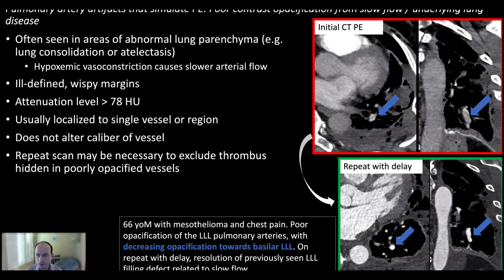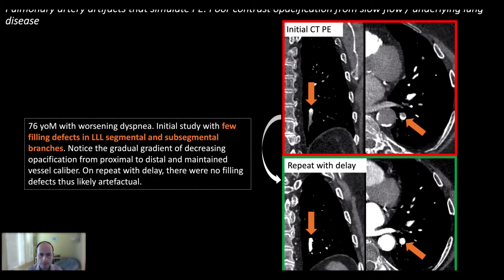Other clues: thrombus tends to be low in attenuation, around 40–50 Hounsfield units. If you measure the filling defect and it's much higher than that, it's almost certainly not thrombus. These defects tend to be ill-defined and wispy, and will not alter the caliber of the vessel. If you have any question, it's very easy to just repeat with more delay.